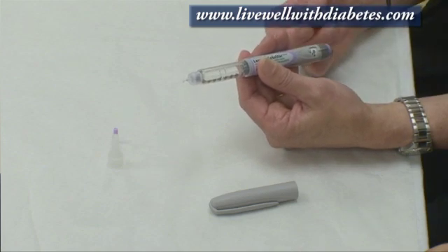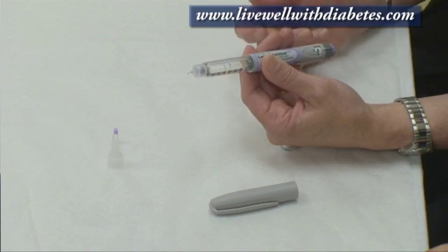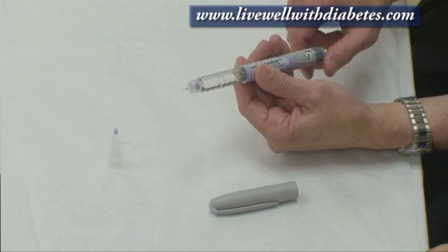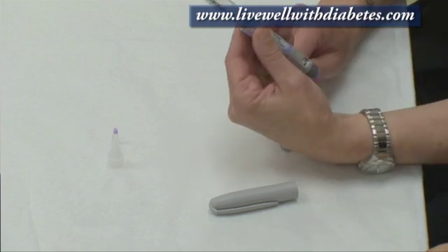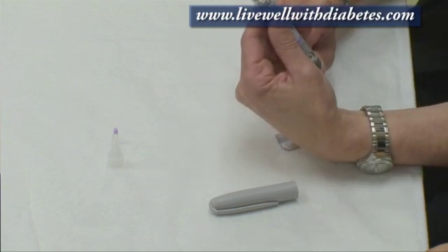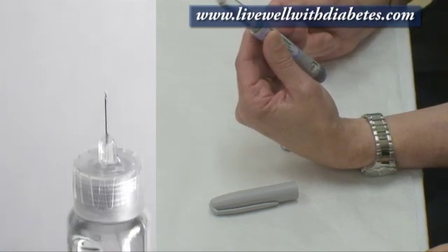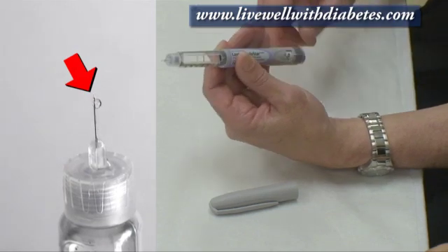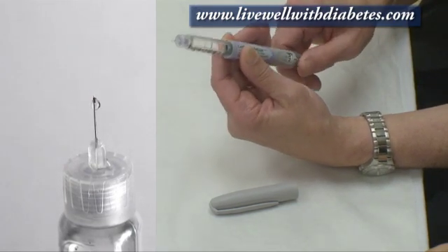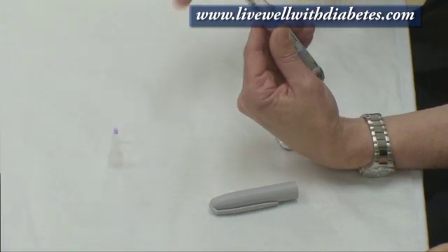Before each injection I'm going to prime the pen, or do what's called a safety check. To do the safety check, I would turn it to number one, point the needle up, and push the button. When I push the button, this will turn to zero and I should see a drop of insulin come out. If I don't see a drop, I repeat this step — turn it to number one again, point the needle up, push the button, and I'll see a drop of insulin come out.